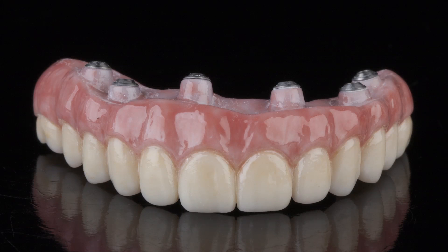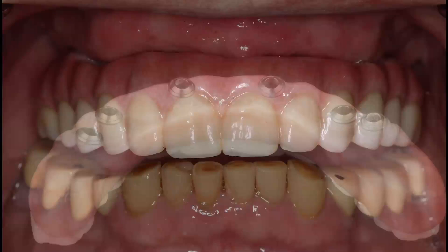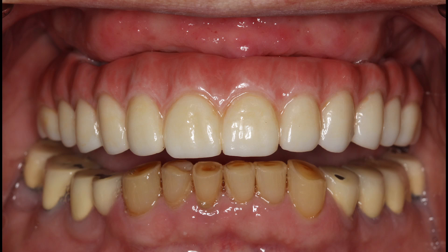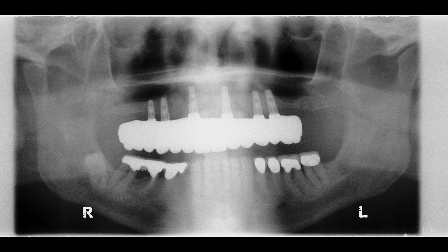The final Bruxer full-arch implant prosthesis was milled from the same CAD/CAM design used to produce the provisional. Six titanium inserts were permanently bonded to the precise positions needed to connect to the implants with a passive fit. The final prosthesis was seated in the patient's mouth and the prosthetic screws were tightened to the appropriate torque per the implant manufacturer's instructions, or 25 Ncm. The access holes were then sealed with composite. The final restoration fit perfectly upon delivery and met the expectations of the patient and the doctor alike, with the patient extremely pleased with the aesthetics of the final restoration, which should enjoy the same long-term prognosis as the osseointegrated implants.